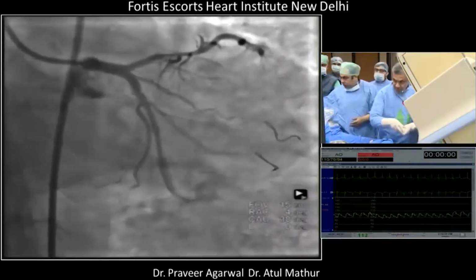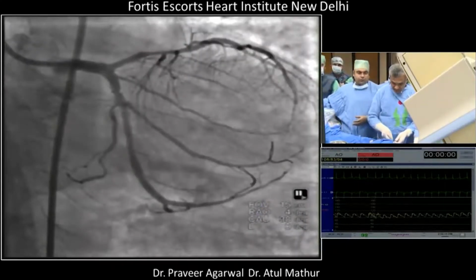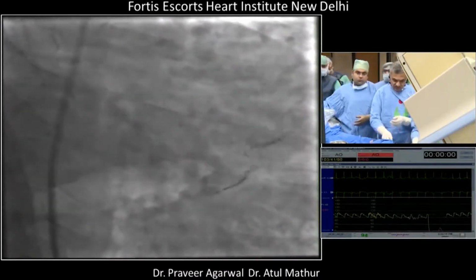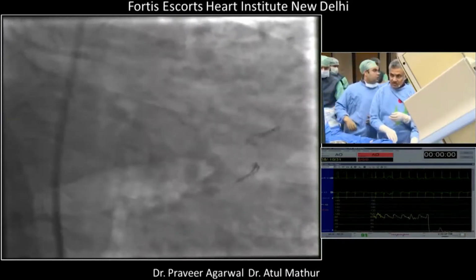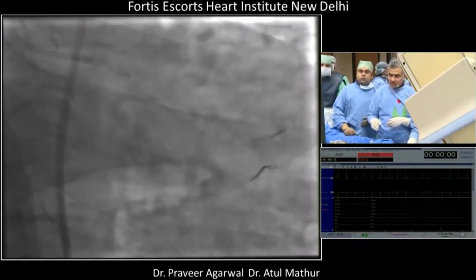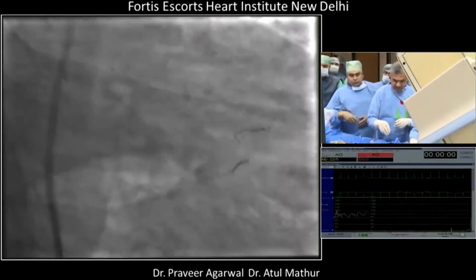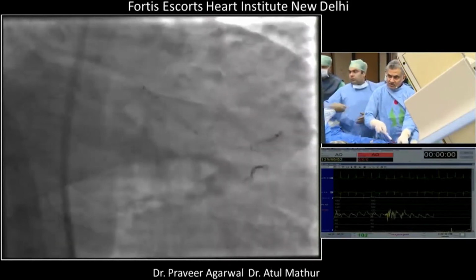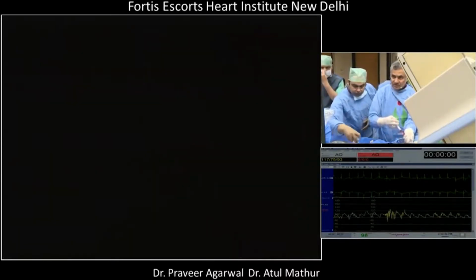Fluid is fast, 100 ml. I just want to ask the panel, how many would use IVUS in these patients in this type of non-left main bifurcation routinely? No, we know, most of us don't use IVUS in every patient, right? In the United States it's only 20% usage. In Brazil, the probe for IVUS costs $1,000. What about in the US? About 600, 700.